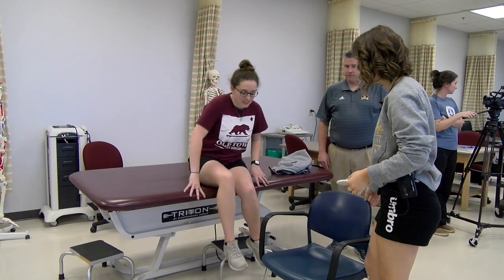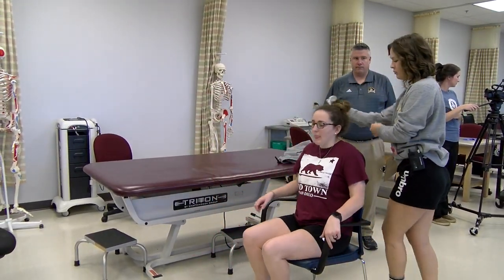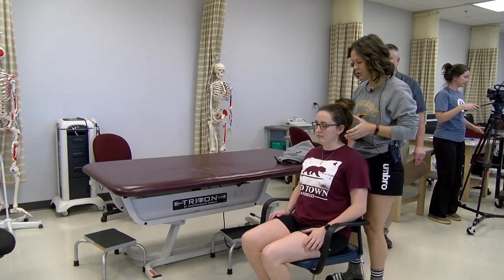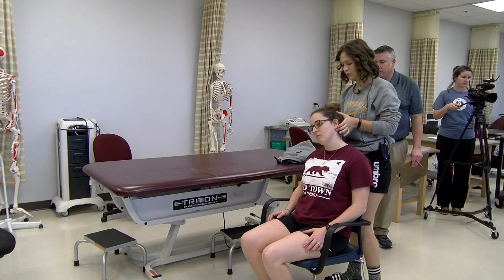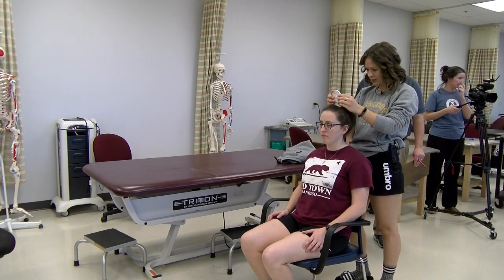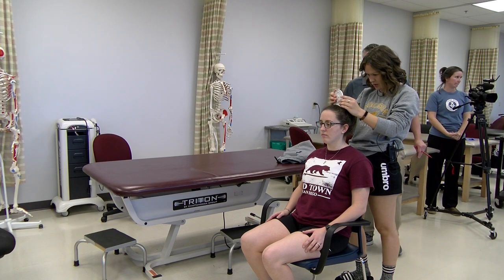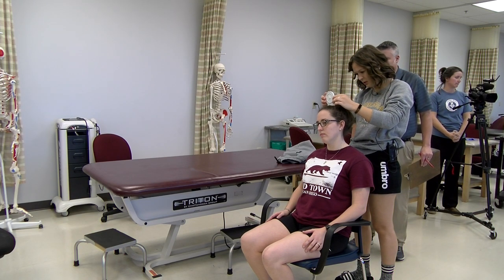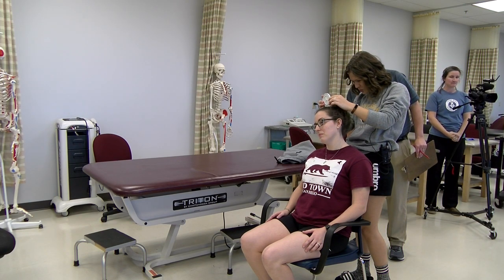Morgan, if you will come and sit in this chair for me. What I want you to do is I want you to turn your head and bring your right ear towards your right shoulder. Go ahead and do that motion for me. I am getting 25 degrees.